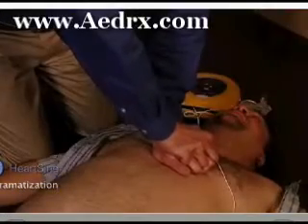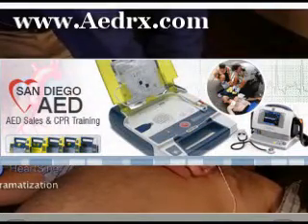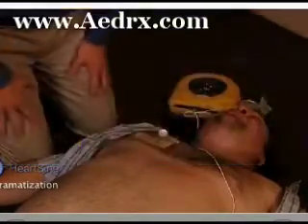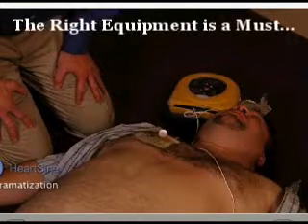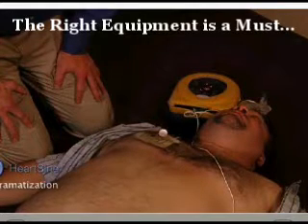Recent AHA guidelines recommend that CPR can be performed without exchange of breaths. We recommend that everyone take a CPR AED course. Stop CPR. Assessing heart rhythm. Do not touch the patient.